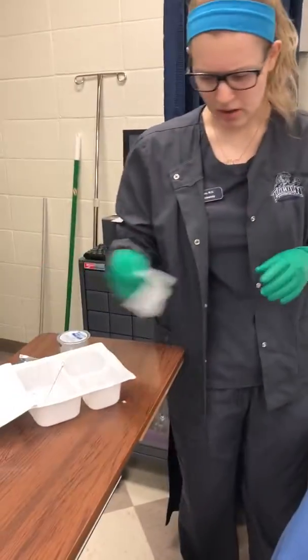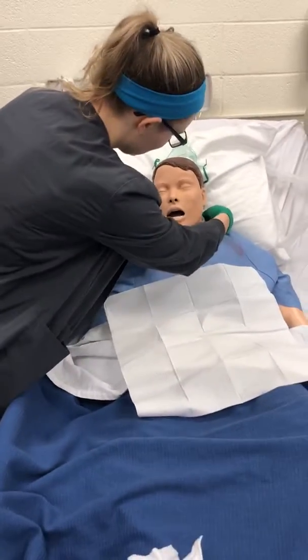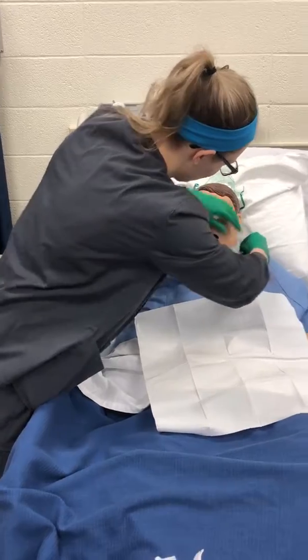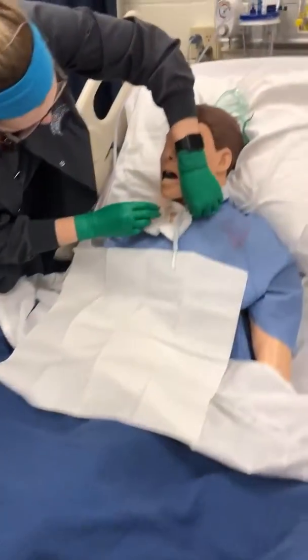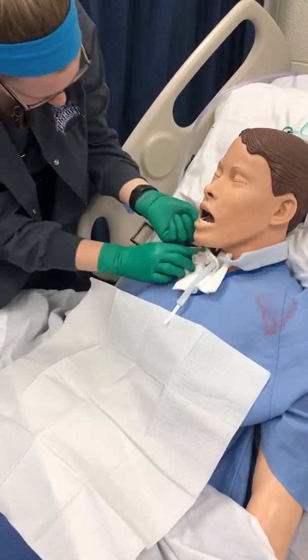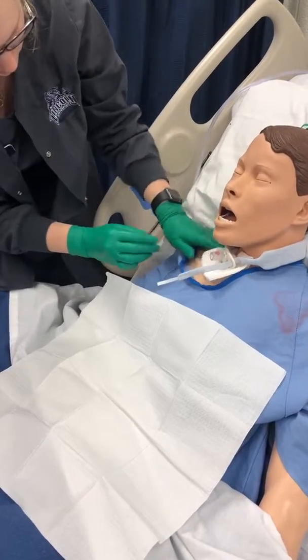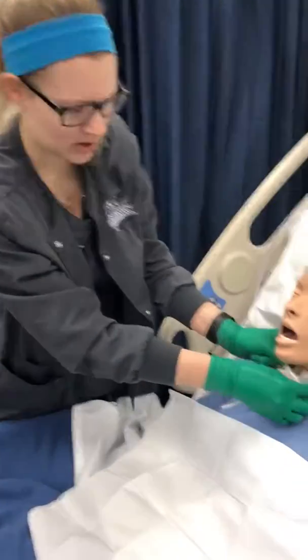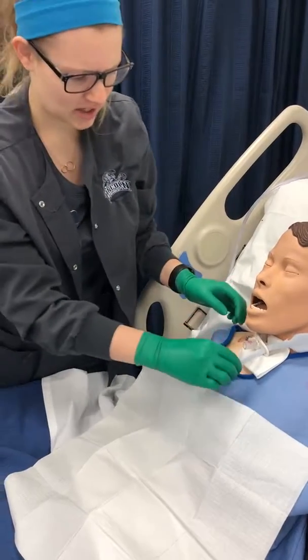And then we're going to put our gauze under the plate. You can disconnect the side of the trach tie just to give you some room to put the gauze under the plate. Just make sure that you're watching and looking at the skin and assessing that there's no erosion or anything, because all the secretions that can build up can really cause irritation on the skin.